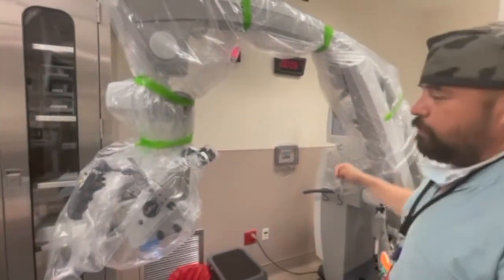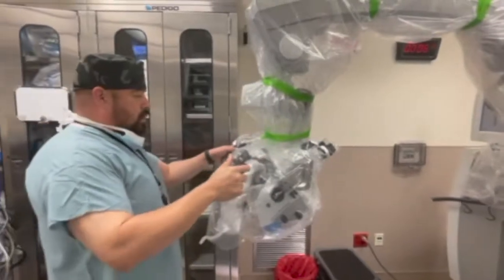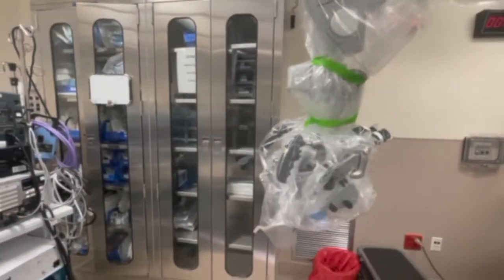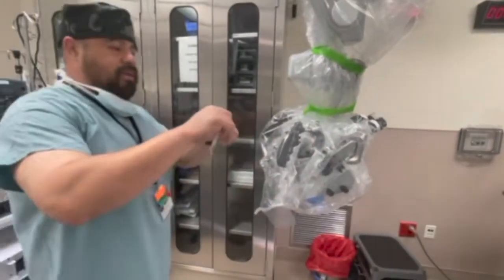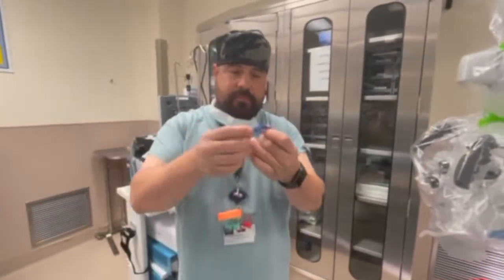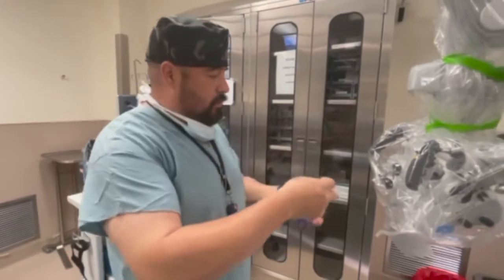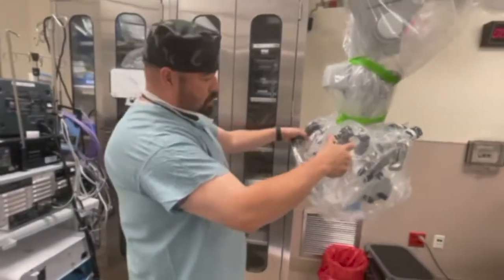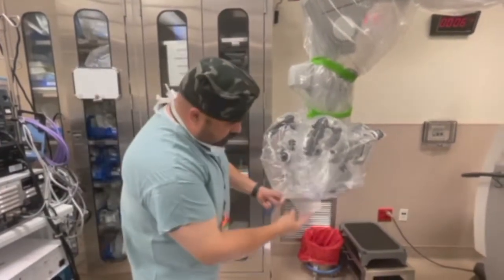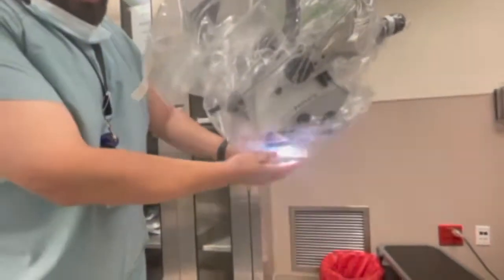And remember, I was telling you guys about the rubber bands earlier. I'm gonna show you how the rubber bands will work. Let me get them from your sterile field. You go, you get them. Yeah, I get around two rubber bands. First spot. So the main part is that the surgeon can see. If you don't put a rubber band here, the drape is going to be in the surgeon's way, right here. So this one is pretty much the main one.